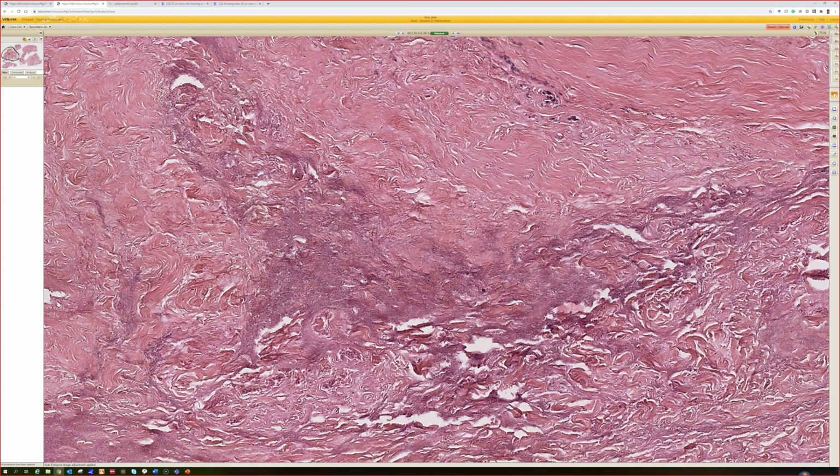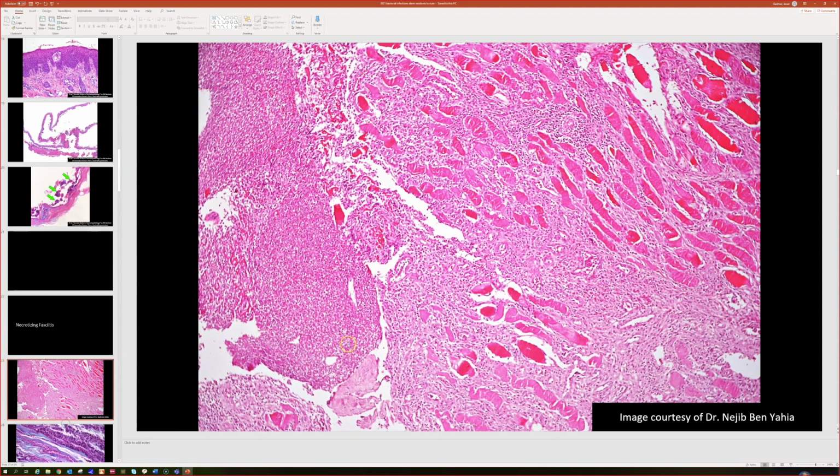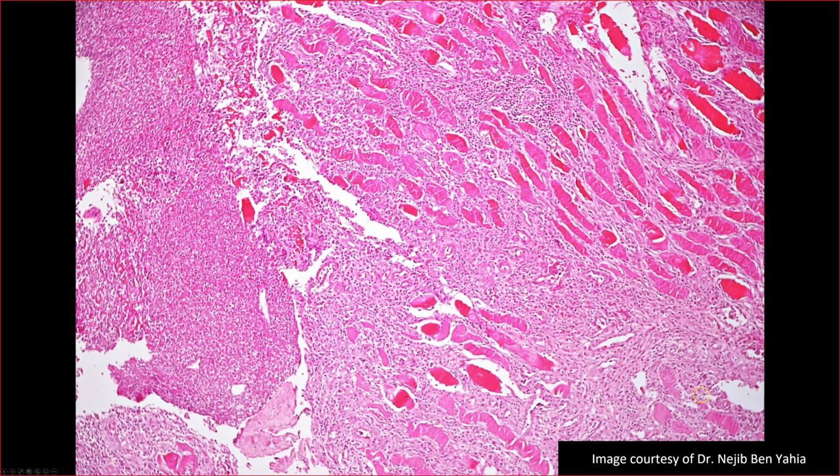Tons and tons. So almost always, again, I've only seen a few cases, but really what I want to see is extensive necrosis, and it almost always goes hand in hand with tons of bacteria growing right in the midst of the dead fascia and dead skeletal muscle. And making this diagnosis is important. Again, it's a rapid, really a serious thing. And so it's important. So here's two pictures I'll show you that are a little bit more clear.